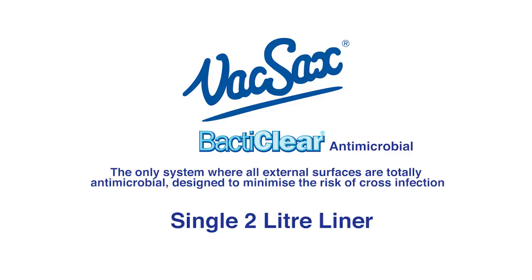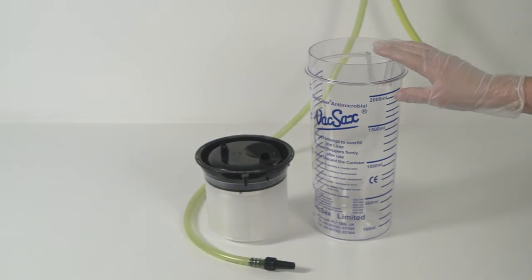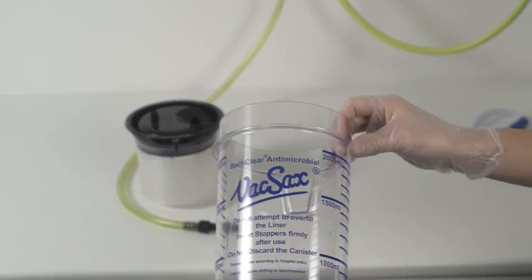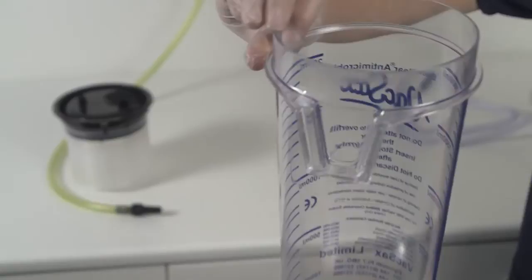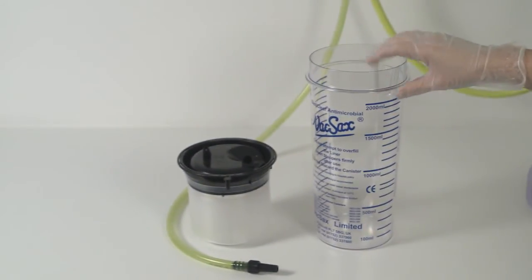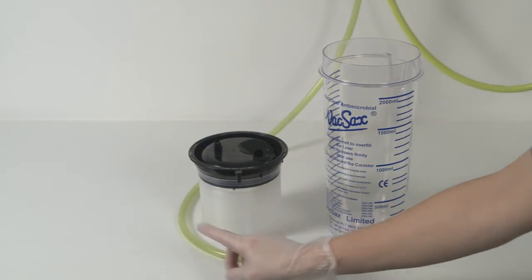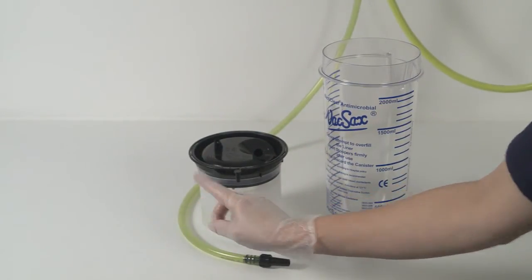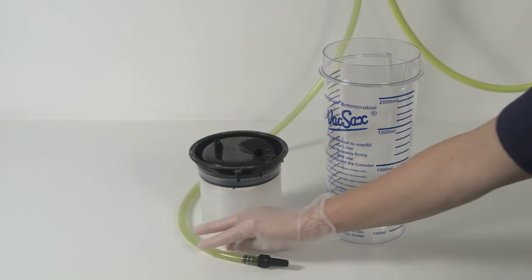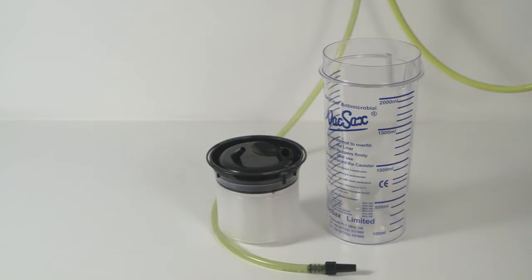The single 2 litre liner. For this you will need one 2 litre standard canister, one 2 litre standard blacktop liner. Note the vacuum port and then the patient port — these are unique and cannot be misconnected. And a 1 metre length of non-disposable yellow vacuum tubing kit.